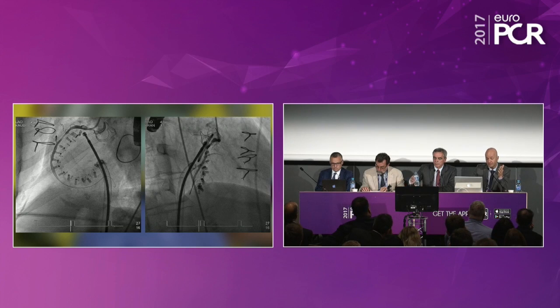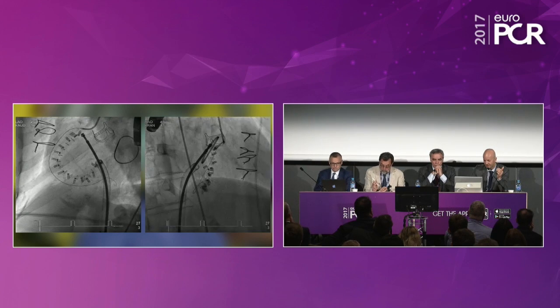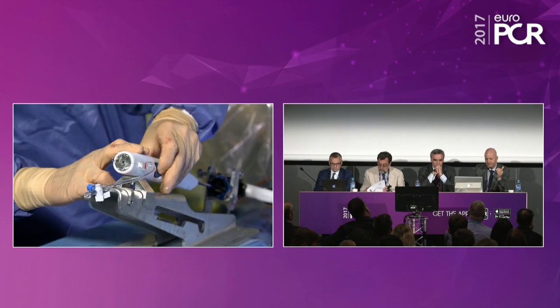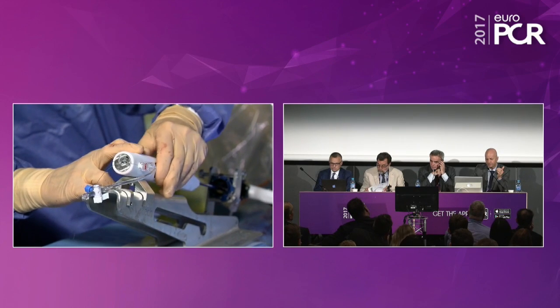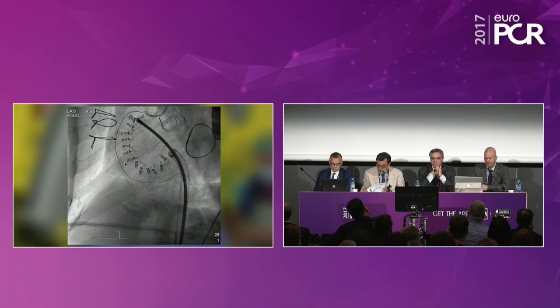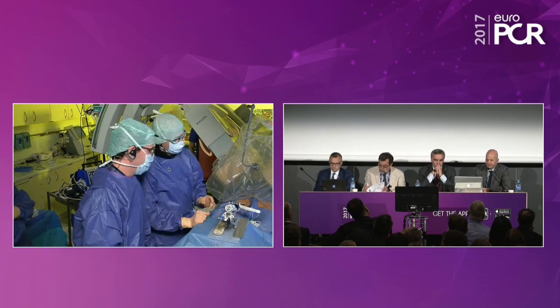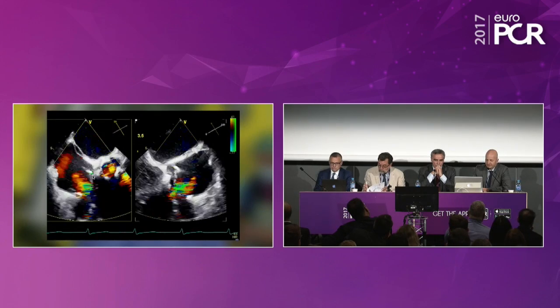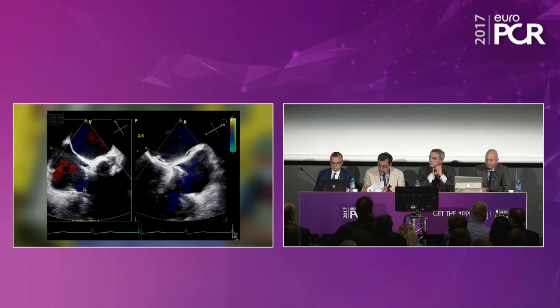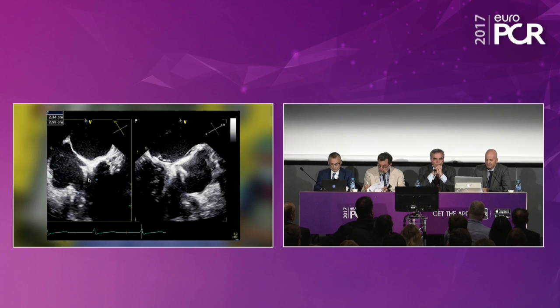And if you would look at patients after TR reconstruction with an open heart surgical approach, you would see exactly the same thing. You can give them adenosine or nitroglycerin. This is the cinching here. You go on with the cinching process, and I will show you in a second the end point, or the last cinching point. I will show you an echo later on. If you recall the massive TR up front, this is a very nice result.